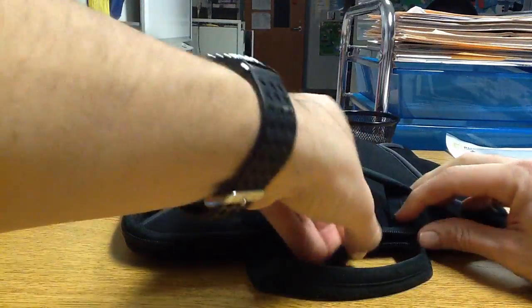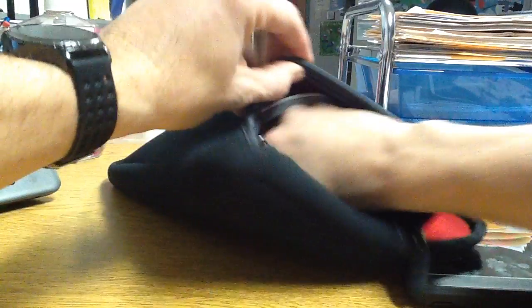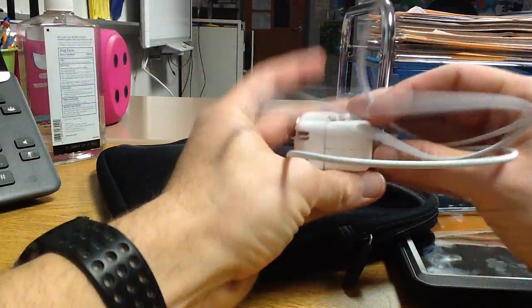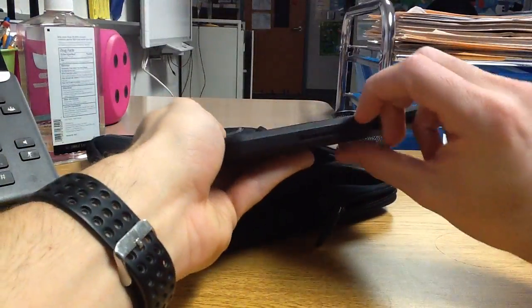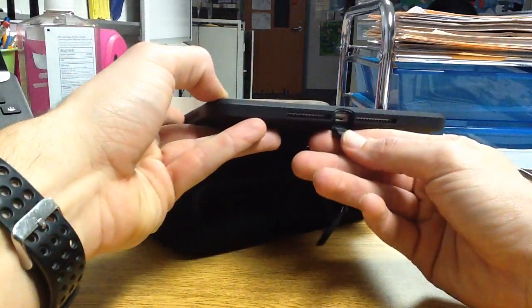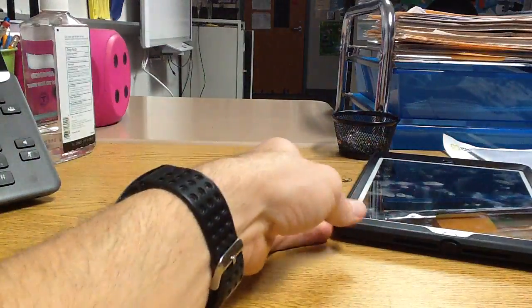This is Dallary's new device. It's an assistive technology communication device, and I believe it's an iPad. It comes with a charging cable, and it's a lightning cable, so that'll go right underneath the home screen, right there. Plug into that. That's pretty simple. Most people know how to do that, so I'm going to set that aside.